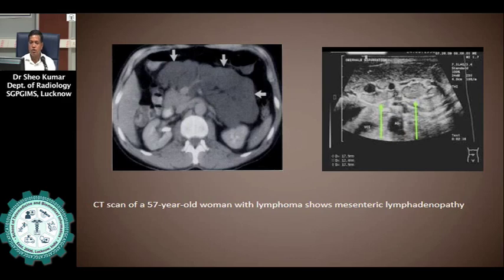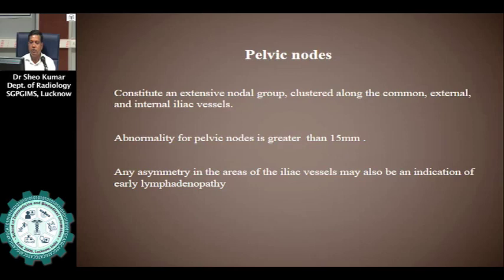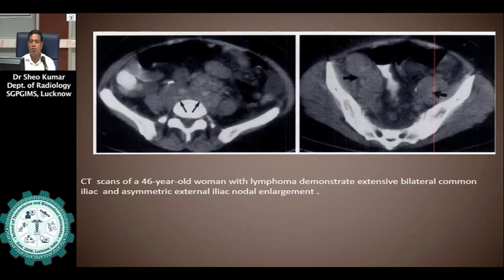The pelvic nodes constitute an extensive nodal group clustered along the common, external, and internal iliac vessels. Abnormality for a pelvic node is greater than 15 mm. However, any asymmetry in the areas of the iliac vessels may also be an indication of early lymphadenopathy. A CT scan shows bilateral common iliac lymphadenopathy and left external iliac nodal enlargement.